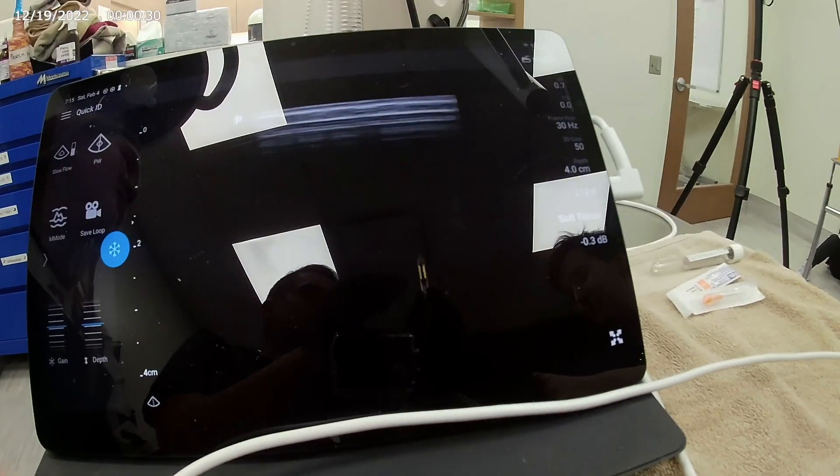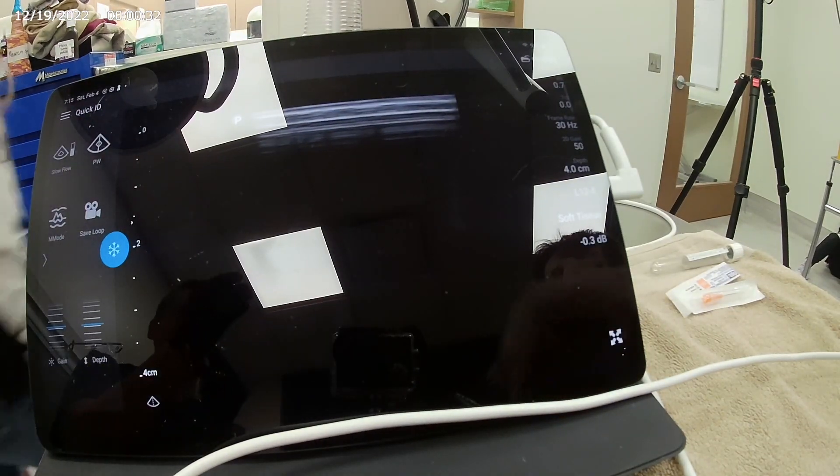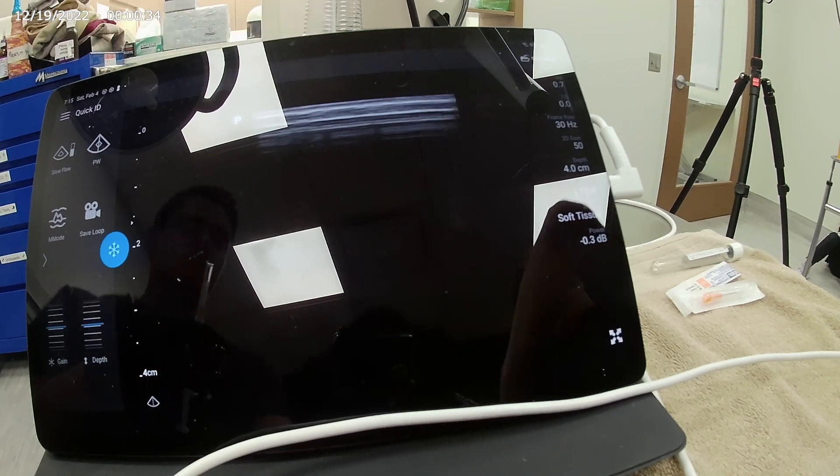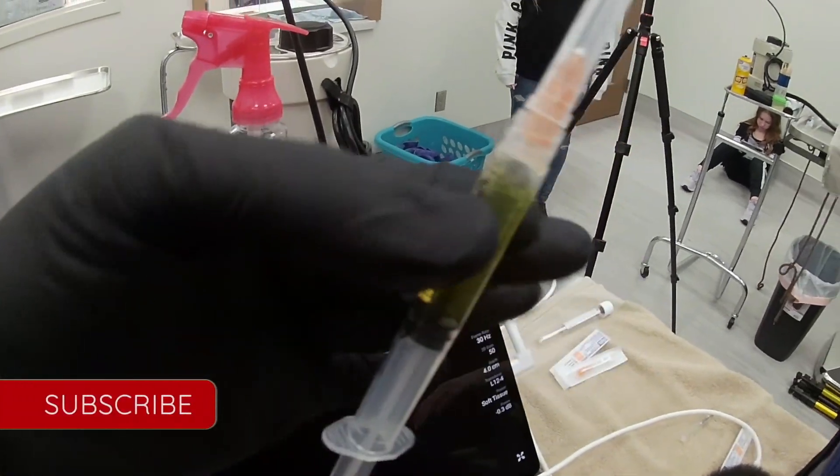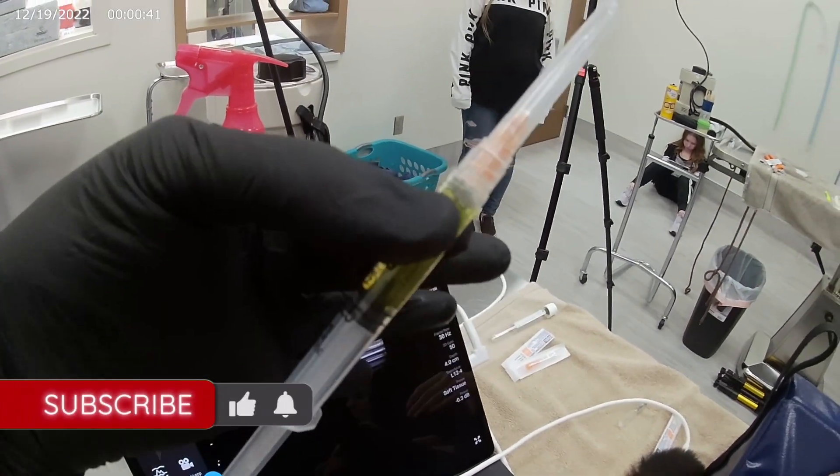After I get between one to three mils of urine — depending on what I need — if I need a culture I'll pull a bit more; for a simple urinalysis I'll pull a little bit less. Then we pull back and see what we've got inside there.